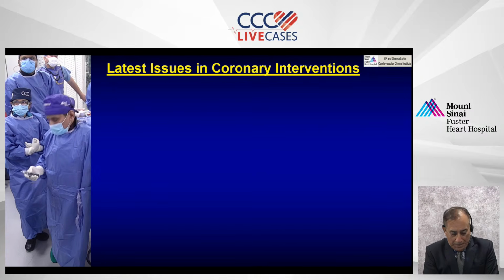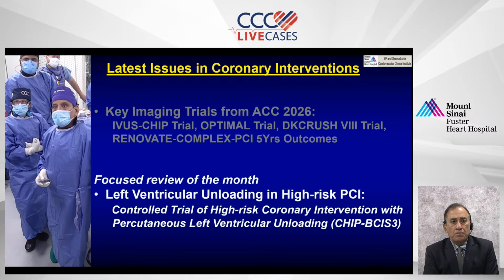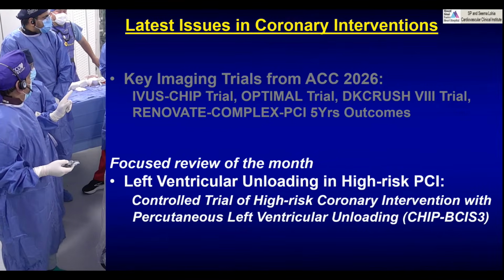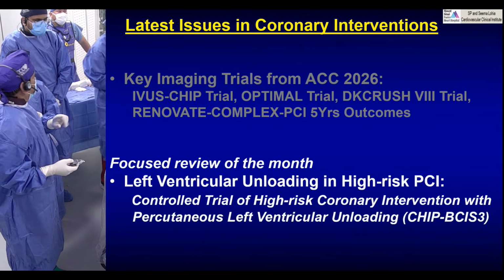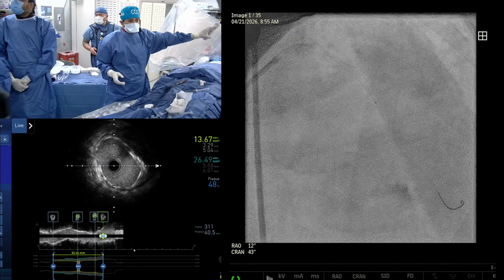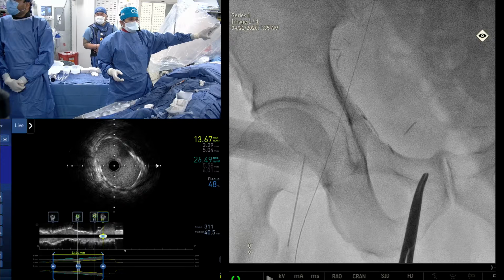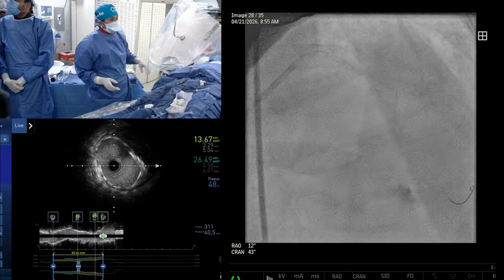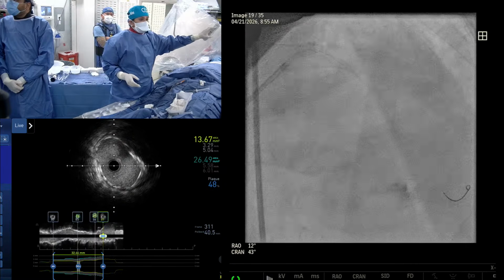Beautiful, beautiful. All right, so let's go to a complete case. Maybe you want to show it now, or your angiogram, and show it later? Okay, we can show. Let's pause here and show the angiogram now. Excellent job has been done by Anu. Show it. Okay, let's go back. Anyway, we did the imaging. Show the imaging first.